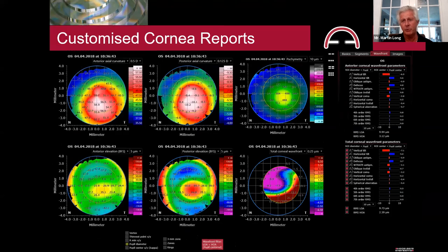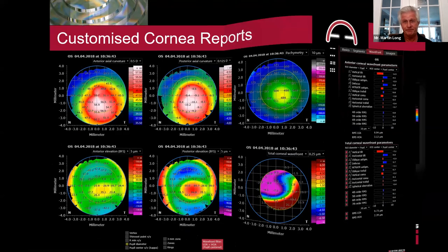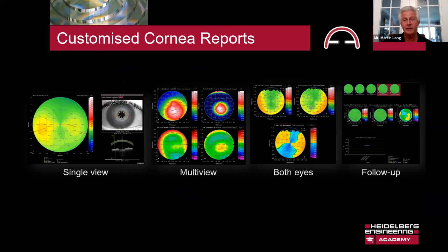You customize the report how you want to see it. So you can have a single view, you can have a multi-view, you can look at both eyes together, or you can do follow-up.